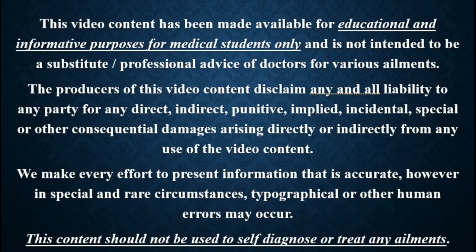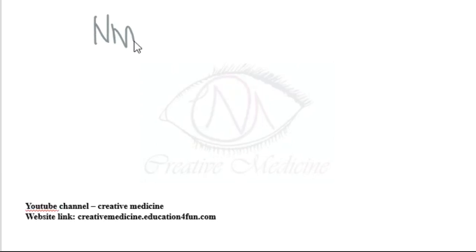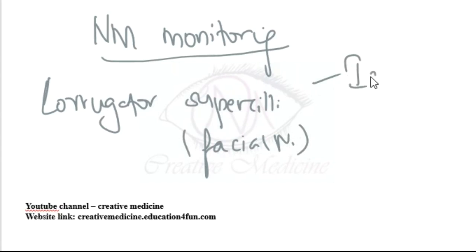In this lecture, we will learn about neuromuscular monitoring. For neuromuscular monitoring, the ideal muscle used is corrugator supercilii, which is supplied by the facial nerve. This corrugator supercilii is the ideal muscle for neuromuscular monitoring. It is more commonly used than the orbicularis oculi.